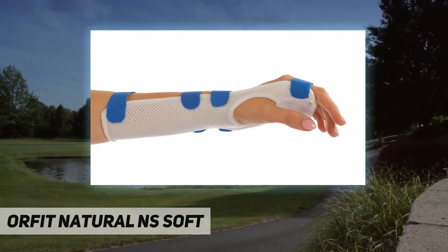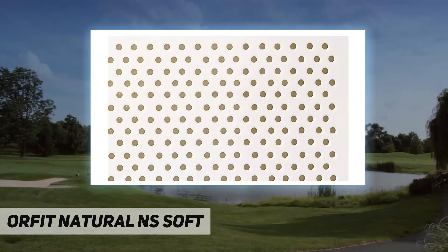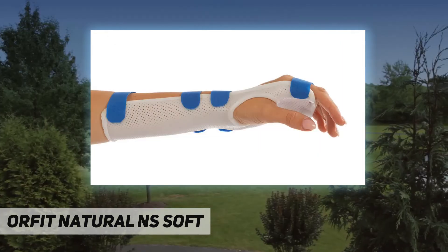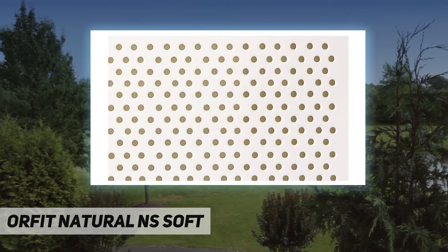When ready for molding, the material turns transparent. This material features a smooth white finish. The item shown is Orfit Natural NS Soft, 18 inch by 24 inch by 1/8 inch, maxi perforated.